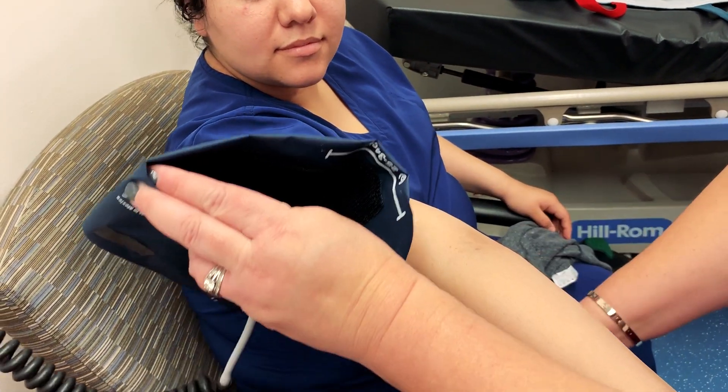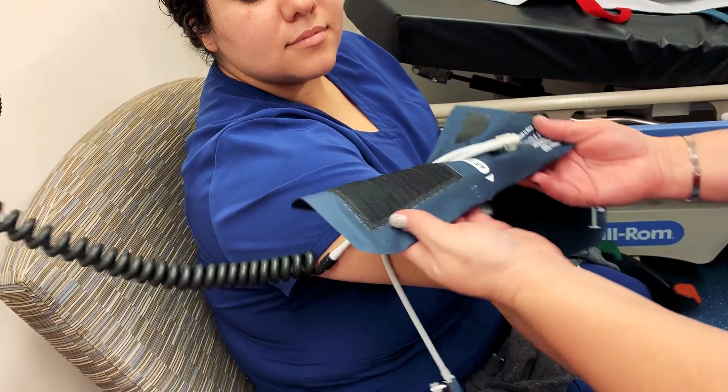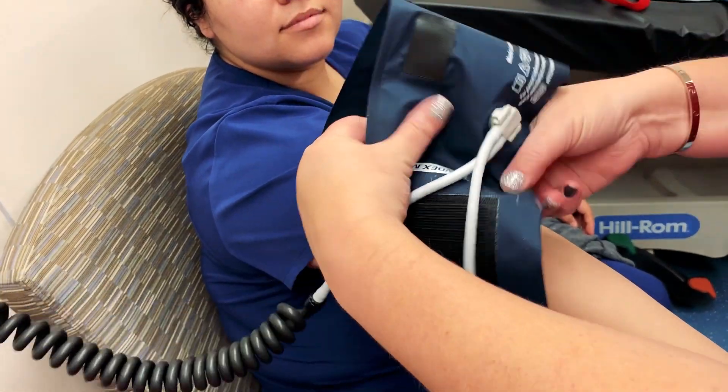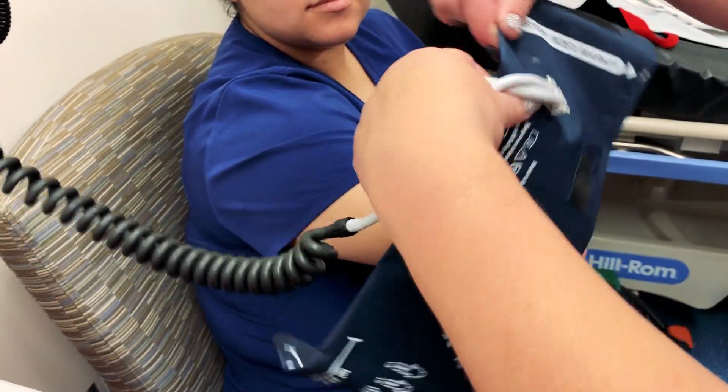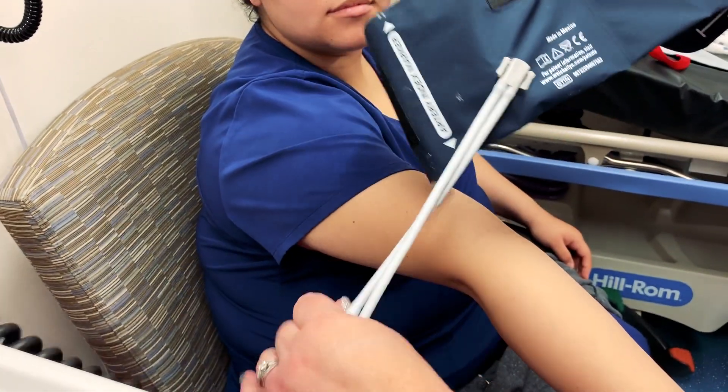The artery marker — or artery index marker — is where we are going to place the cuff over that pulse point. Now let's get this all straightened out and turned around here.